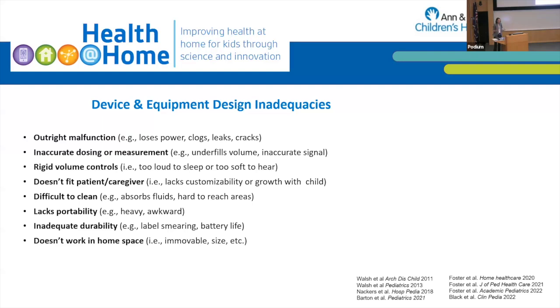We see outright malfunction, right? When something loses power, clogs, leaks, or cracks in the middle of using it, it's really significant. But we also hear about things like inaccurate dosing. When the medication pump doesn't get all the medicine there, you as a parent really worry: did my child get the full medicine? Did they get the full feed? These are things that are happening at home for our patients on a daily basis.